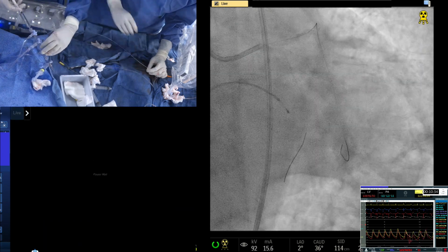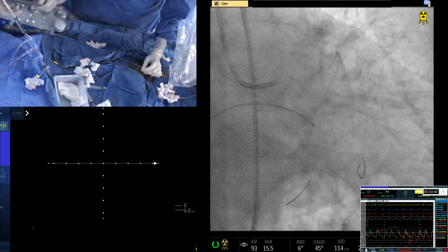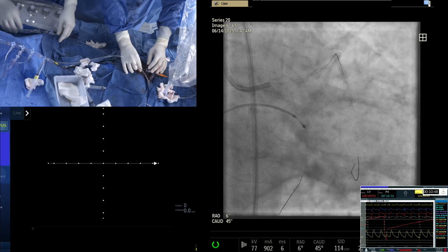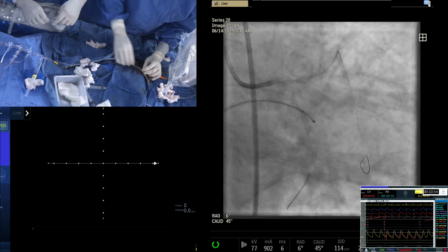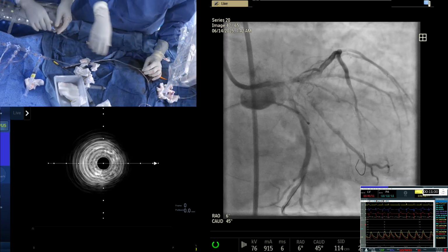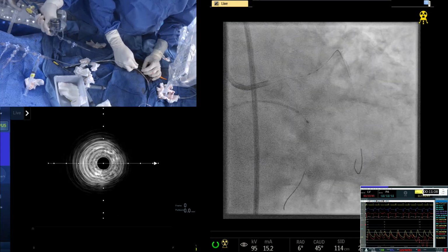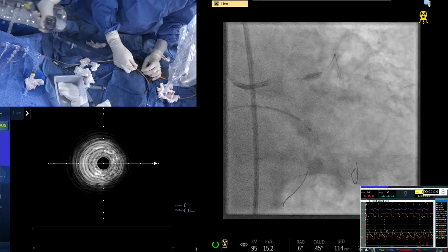You want to take a picture now? Yeah, I mean, the ostial circ will look not pristine, but that's okay. Good. Let's take it out. I'm thinking that you want to do some more there. Where? Just proximal to the septal, that's where we are going now. Here. Okay, go. And this is where probably there was the ring calcium on the IVUS. That's correct.